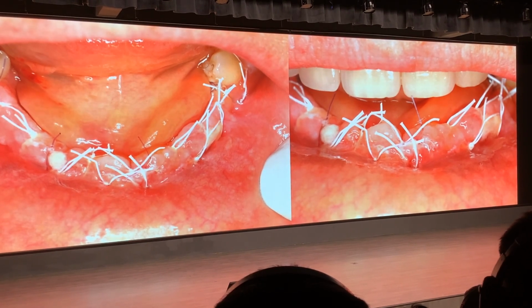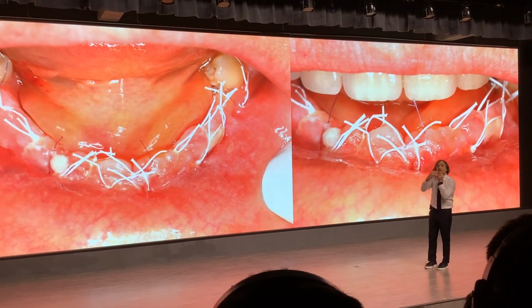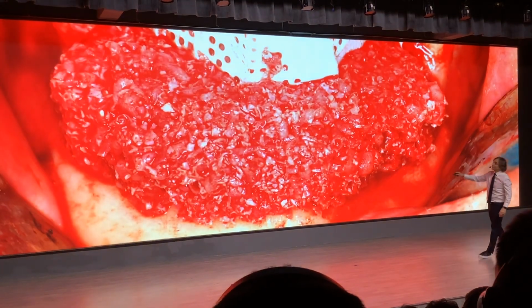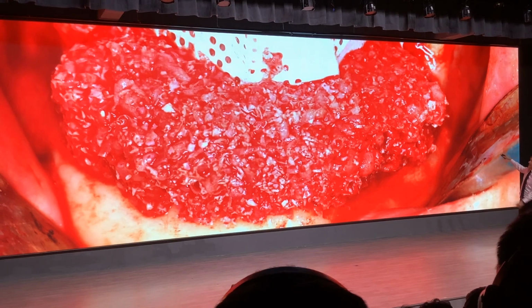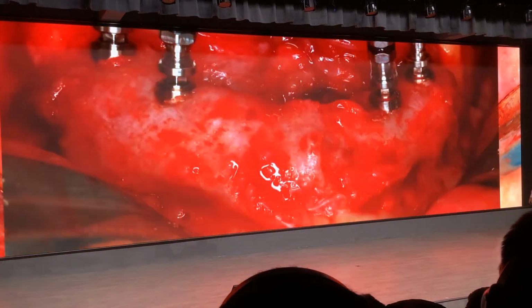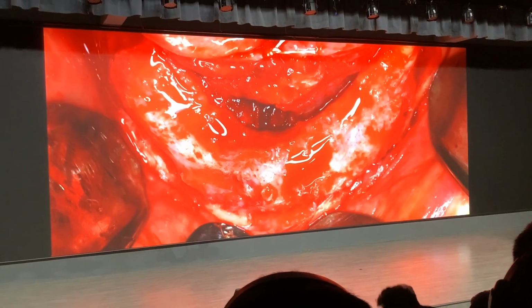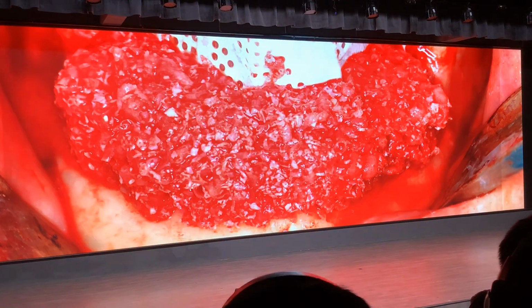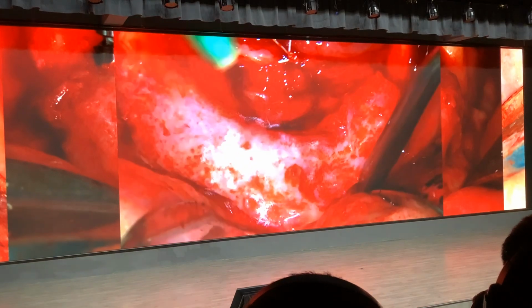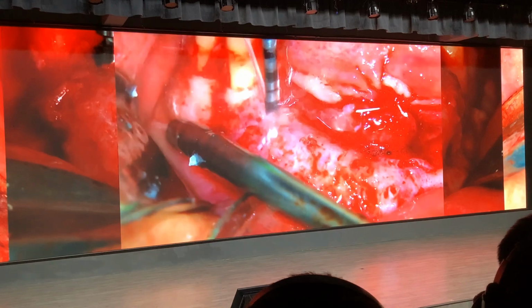Biologically, the most difficult bone graft is this. Biologically. Narrow down here and wide. Look, narrow down, but look how much bone. Scraper. What do you think? Oops. Okay. There it is. It's cortical bone. It's a new mandible.